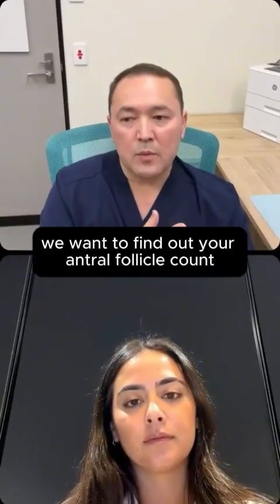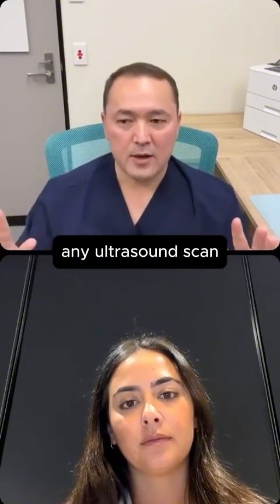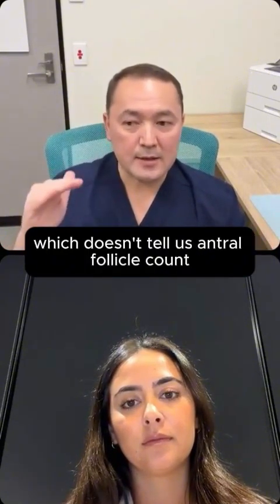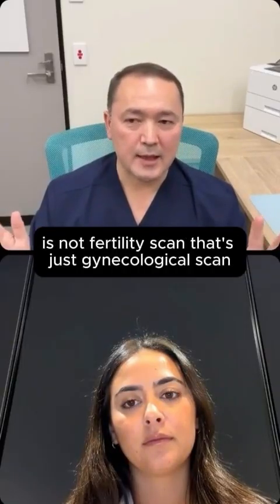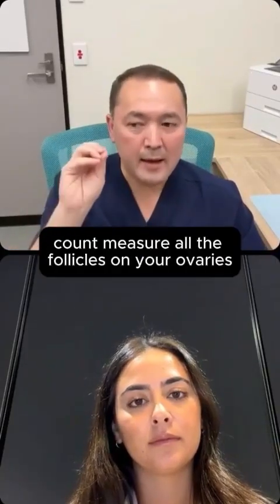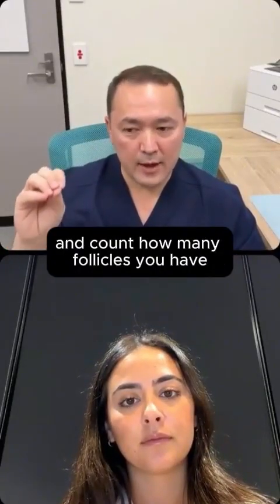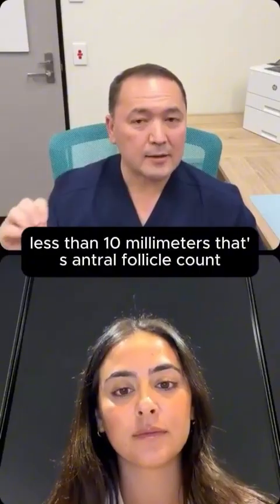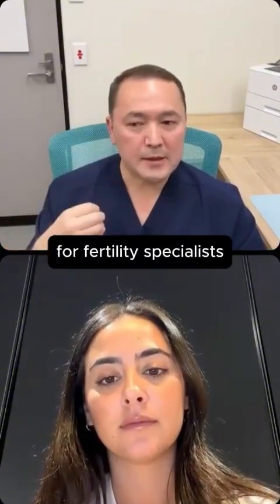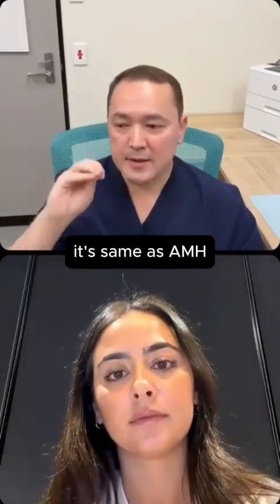And also we want to find out your antral follicle count. Any ultrasound scan which doesn't tell us the antral follicle count is not a fertility scan. That's just a gynecological scan. Antral follicle count means the sonographer should measure all the follicles on your ovaries and count how many follicles you have less than 10 millimeters. That's the antral follicle count. This is very critical information for fertility specialists because antral follicle count tells us about your egg reserve.